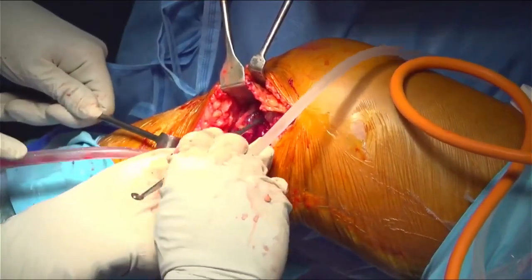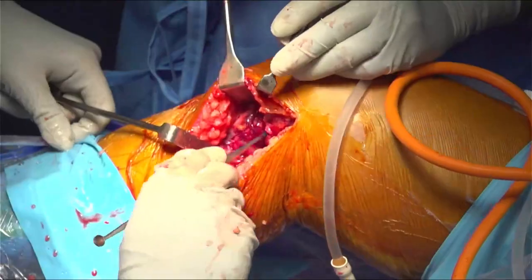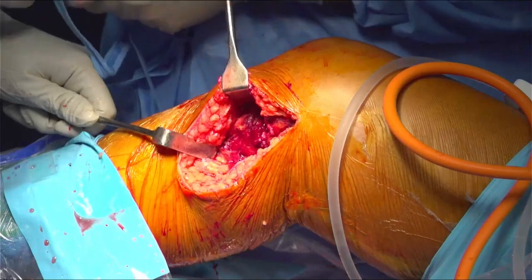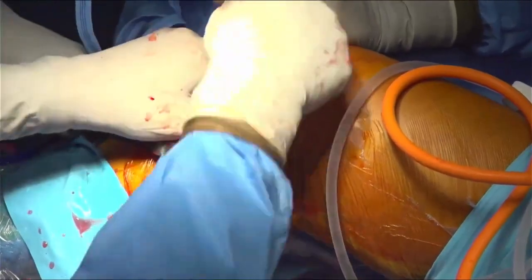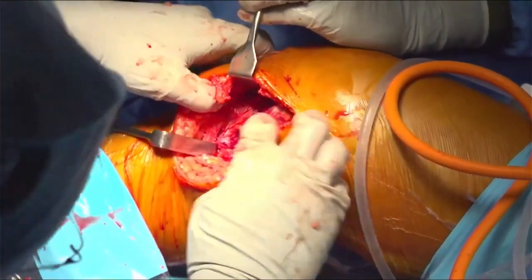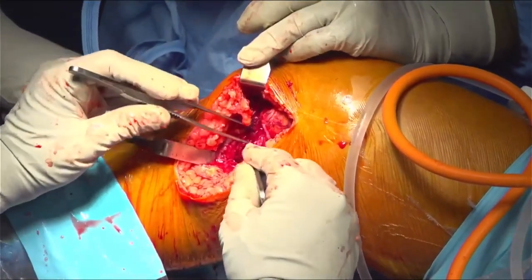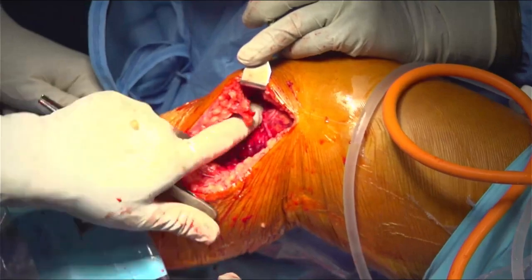5.5 mm PEEK anchors please. Now a knife, artery forceps, artery, knife. Knife please. Anchor please.